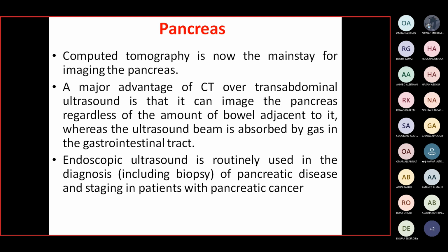Endoscopic ultrasound is used commonly for diagnosis of pancreatic tumor, and this technique gives us a role in taking biopsy.